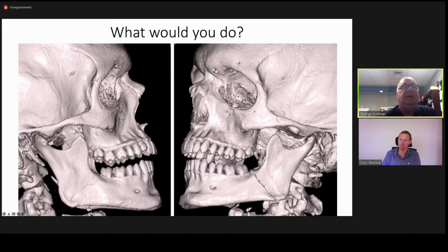Question about bad effects on roots and periodontium when wired around root necks. I'll answer this quickly. Normally for a short period of time, the gums may get inflamed, et cetera, but normally it's not a long-term problem. Intermaxillary fixation, arch bar has been used for an awful long time. So I think the ill effects are transient.